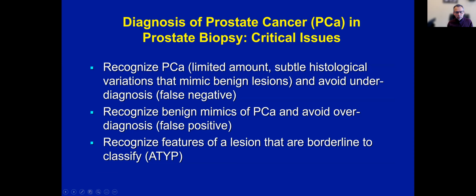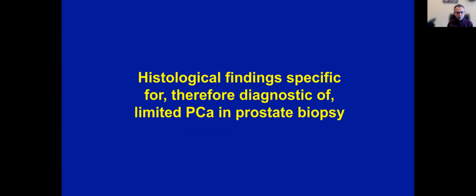It is very important to keep in mind that these 3 critical issues that you are going to face while interpreting prostate needle biopsies are highly interrelated. This is what I refer to as an integrated 3-step approach to prostate cancer diagnosis. And I will talk and emphasize quite a bit about that all throughout my lecture.